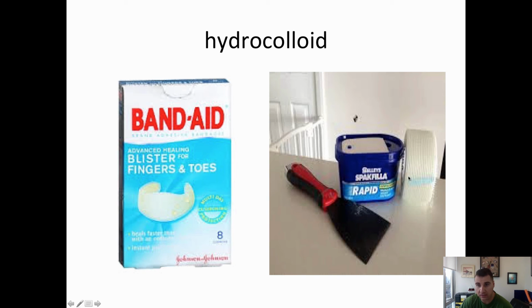But they do more than just the Aquacel, because on their own they also protect. So it's like a little kit for patching holes. That's why they're great for blisters. That's the main reason they're sold, but I use them as well for burns and little cuts. If you cut yourself with a knife or something like this, I wouldn't go straight to the Aquacel unless it's a major hole. But if it's a small laceration, then the band-aid does a better job.